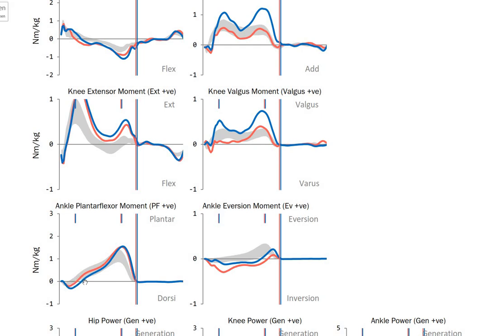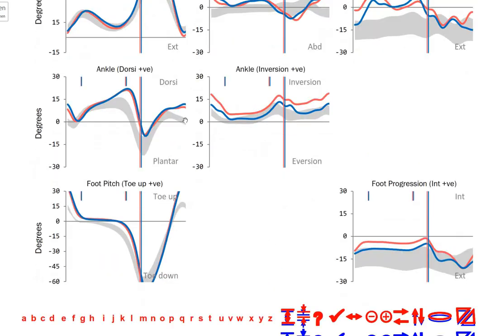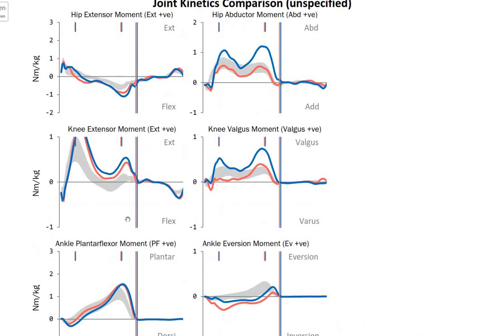For example, at the ankle we can see an increased plantar flexion moment at toe-off and a reduced dorsiflexion moment during the loading response phase. We can then try to link this to the actual joint movement — the ankle is in greater dorsiflexion than plantar flexion — which could represent the muscle making more effort to plantar flex and produce a plantar flexion moment at toe-off in order to propel the individual forward.